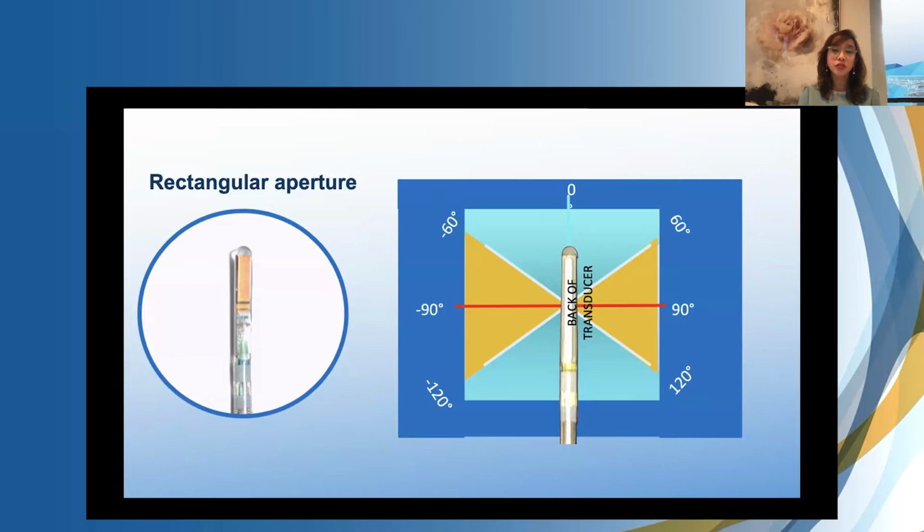The highest resolution is really between 60 and -60, and on the other end is 120 and -120. So really almost all angles are useful for spatial awareness and the location of the device, which is really important. And for a more detailed study for your tricuspid TEER, especially when it comes to leaflet insertion, you want to keep this zone over the area of interest because it gives you your highest resolution. And that's why 3D navigation works.